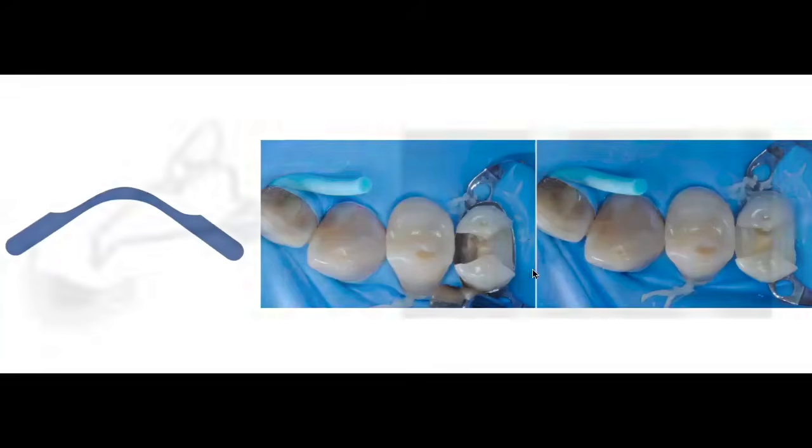So in this clinical case, in the photo in the middle, I'm sorry, let me go back one. You can see that I've already elevated the deep margin on the distal proximal box of this MOD preparation. Now I'm going to do the same with the mesial deep margin. And then I just go ahead and remove this deep margin elevation band, and continue using whatever band you want to use, depending on the type of preparation or the type of restoration that you want to complete this case with. It could be an indirect restoration, like an onlay or something like that, or you can do just an MOD composite, whichever type of final restoration you use for a case like this.